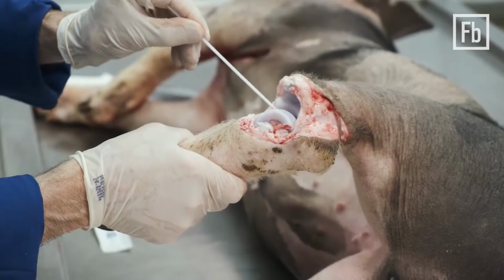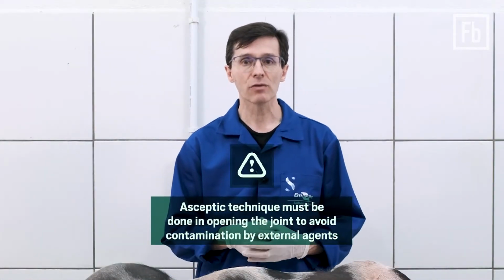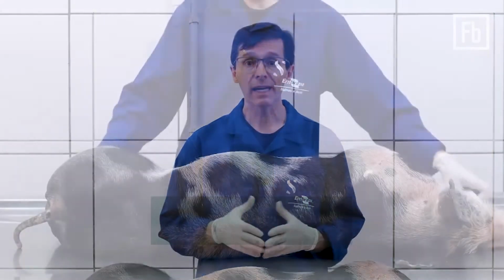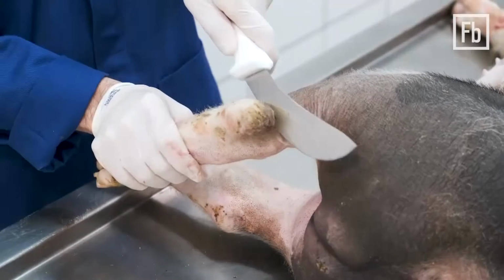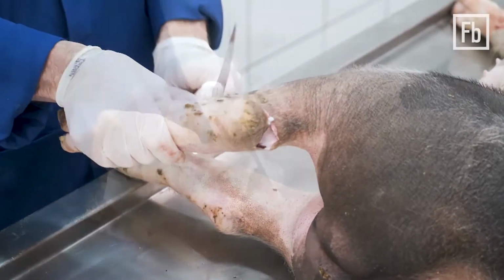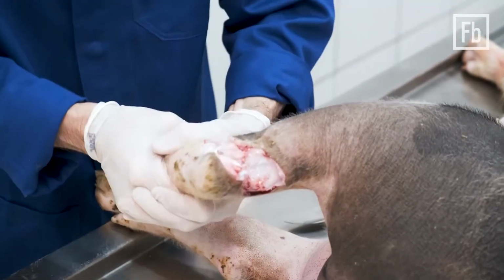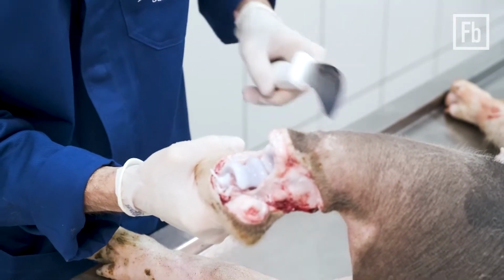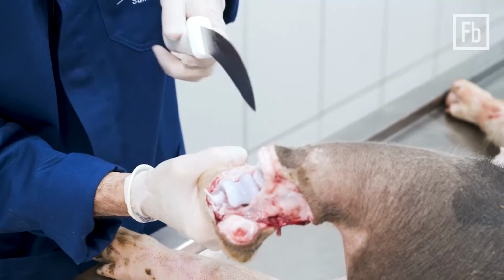The collection of samples for the diagnosis of the agents causing the arthritis is performed with the aid of swabs or sterile syringes. Antiseptic measures should be taken when opening the joint to avoid contamination by external agents. With a clean knife, the skin and tendons are cut without severing the joints. Then the joint is forced open without using the knife. This procedure greatly reduces the chances of contamination.